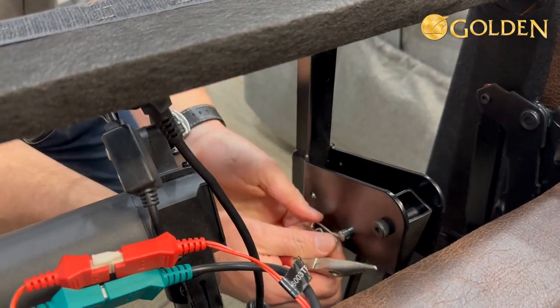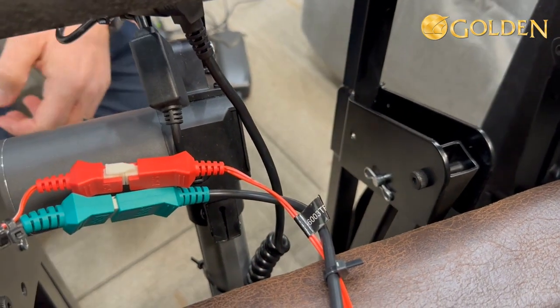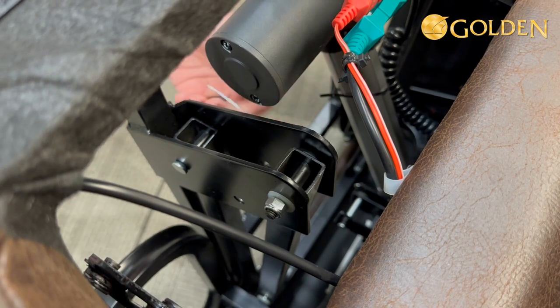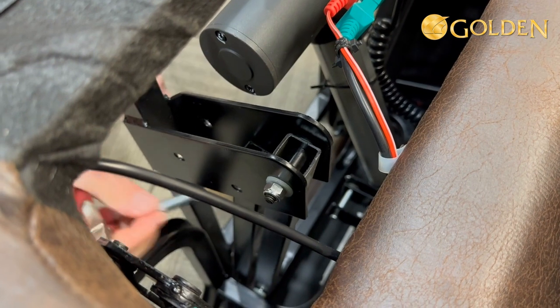Then we'll replace the safety pin here - and now the left side is done. Now we're going to move over to the right side and do the exact same thing: take the safety pin out. That came out nice and easy - move that to the top location.